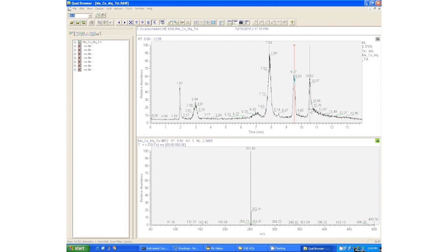When we click on that third peak we see that peak at 251, and that corresponds to methaqualone where the protonated molecule here is 251, and again the log P is what we would expect based on its elution order.